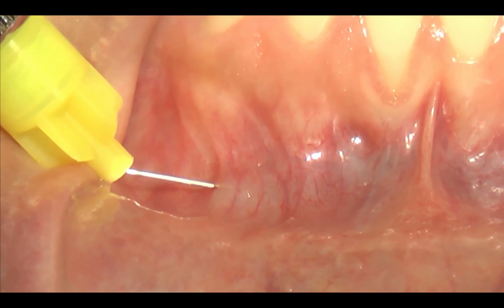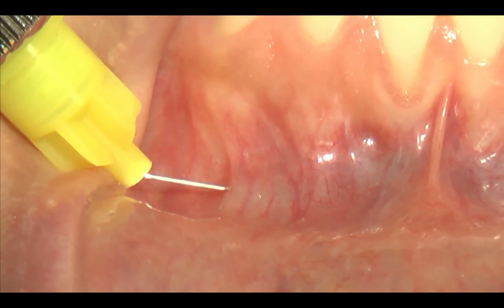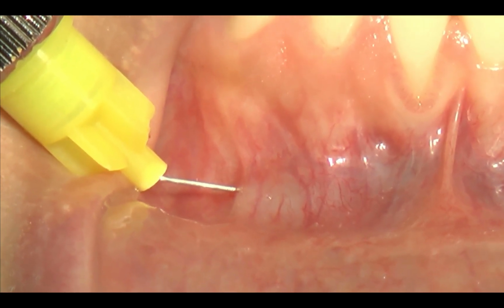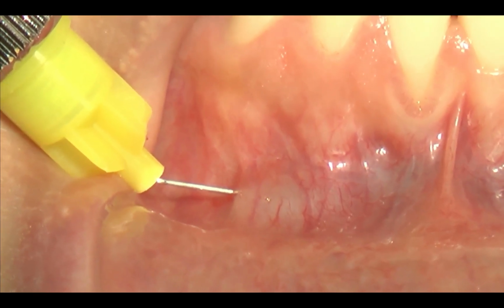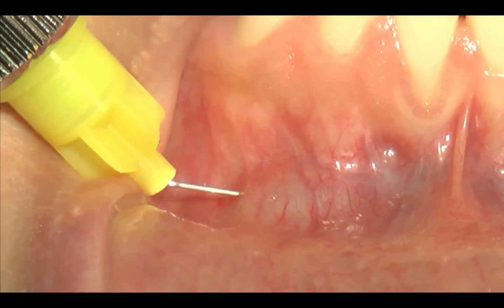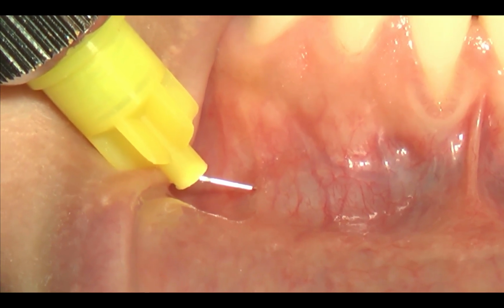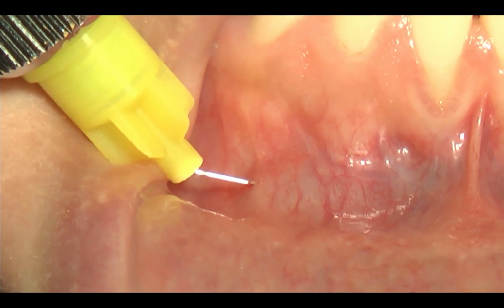As much as you inject liquid inside, I increase the penetration depth of the needle, so it means that I'm taking my anesthetic to the area of the pedicle or to the area of the central incisors. Injection should be made always very slow, not to create trauma, vascular trauma, and also not to traumatize too much the lining mucosa of the lip.